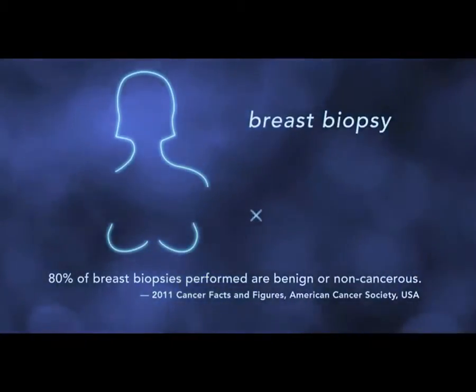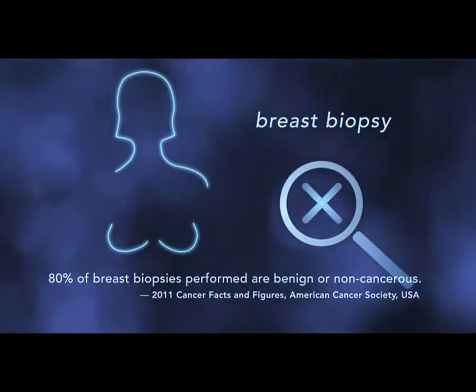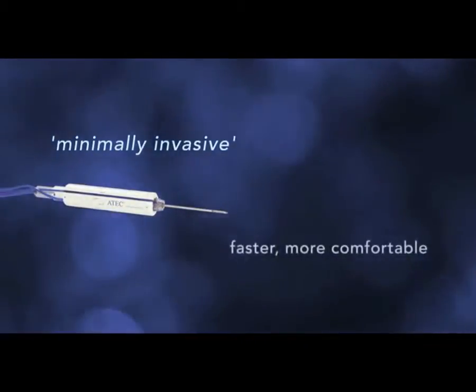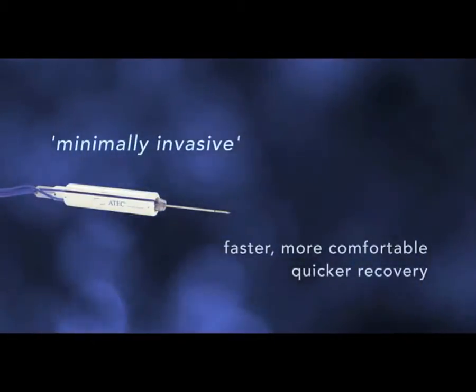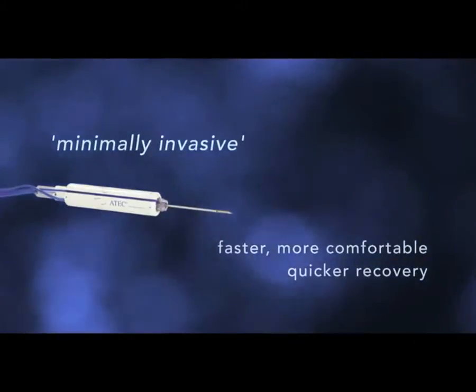That means we take a sample of breast tissue, which is then studied in a pathology lab. Today, we have minimally invasive methods for sampling the tissue. That means we use a needle to take the sample with an imaging system for guidance. It's faster and more comfortable than open surgery, and your recovery time is much quicker.